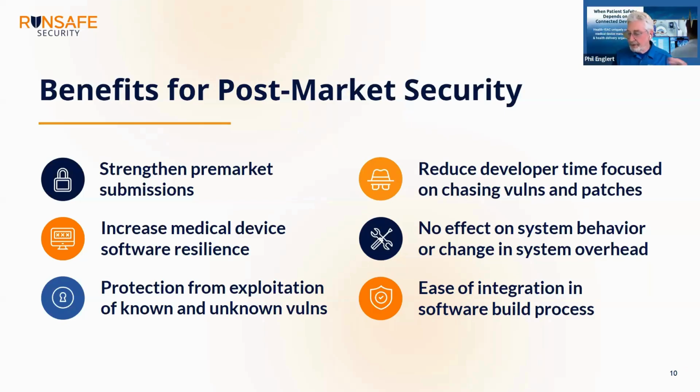Right, right. And speaking of New York City, the FDA has often talked about being able to protect against attacks at scale. If you can attack one pacemaker, how many other pacemakers can be attacked? And the FDA has made it a point that one of the challenges of securing these devices is that human behavior is not predictable. So they take the likelihood of exploit out, and they just say it's either exploitable or it's not. And if it is exploitable and it can produce harm, you need to address it as a manufacturer.